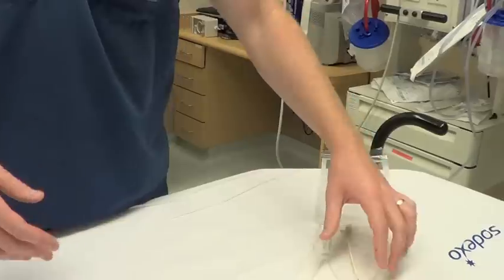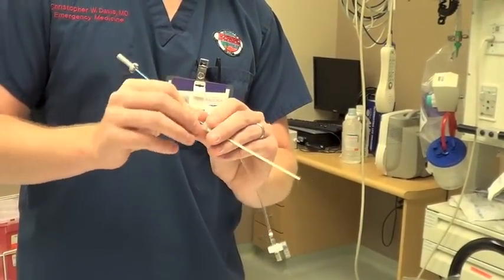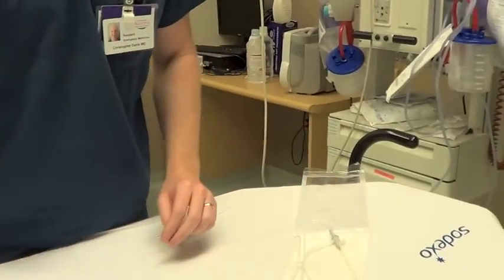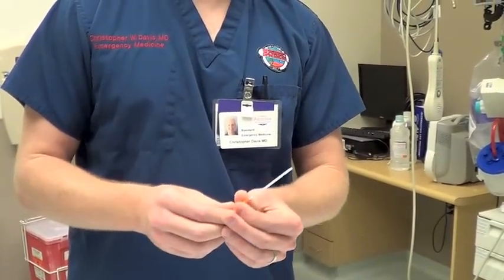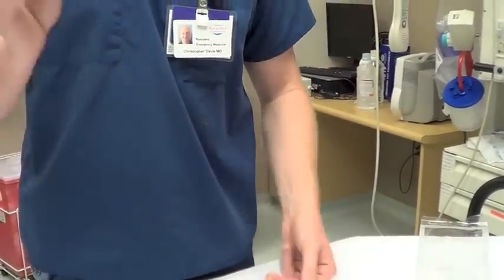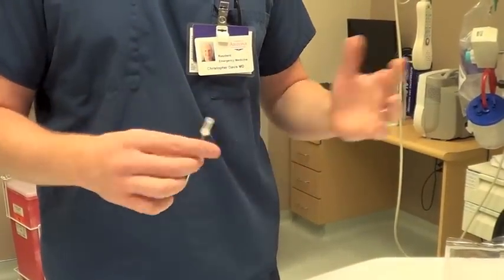Once you have everything open, you have to combine the two kits. The first step is to load your dilator through the diaphragm on top, and it clicks into place on the top of the catheter. You'll also need the needle out of this kit to place your line under ultrasound guidance. Load your syringe on the end and then place your right internal jugular or left subclavian central venous catheter like you normally would, using ultrasound or blind technique.